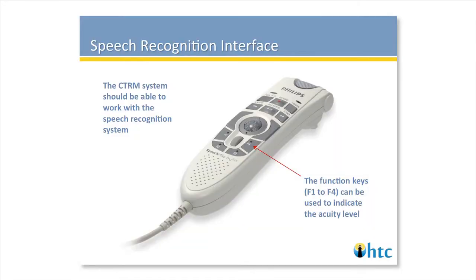Another common way to interface to a CTRM is through the speech recognition system for clients that have that type of a product. I'm showing an example of a speech mic on the slide here. And with that, it fits very well with the workflow because after the radiologist finishes dictation, they can then identify that particular exam as a critical result.